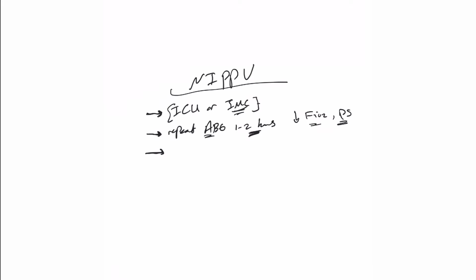The next thing to check for is, is there any air leak and asynchrony? Is the patient having difficulty even with the BiPAP? And this is mainly the RT, respiratory therapist, job. If there is an air leak, you may need to tighten the mask well to prevent that air leak. That means we're losing volume and losing pressure, and that will lead to a big asynchrony. That's the main cause of asynchrony between the patient and the non-invasive pressure ventilation machine.